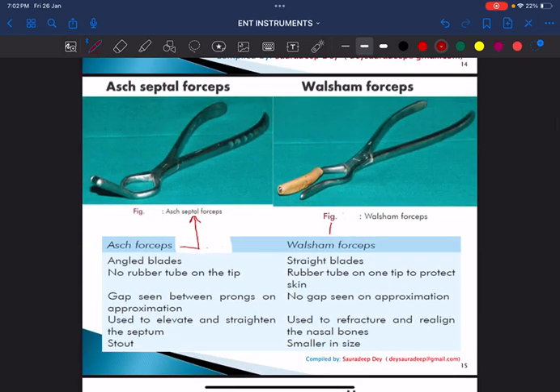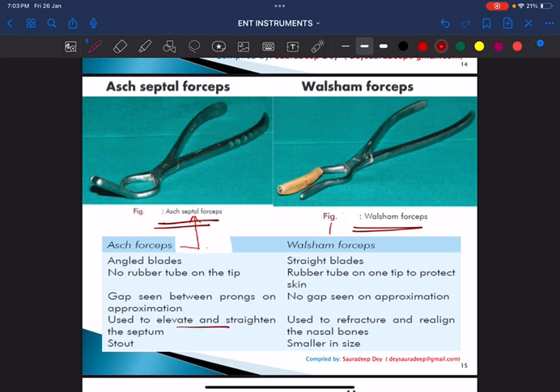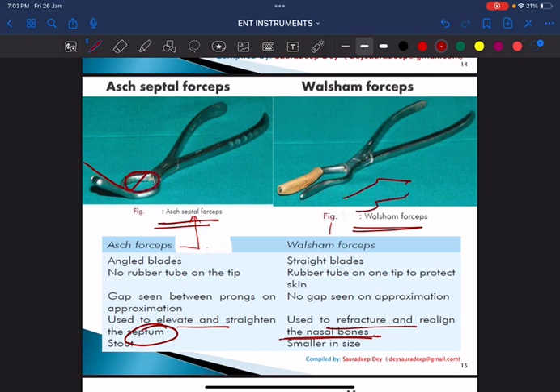These two forceps are extremely important. One is the Ash forceps, which is a septal forceps used to elevate and straighten the nasal septum. The other is the Walsham forceps, used to refracture and re-align the nasal bones. The Ash septal forceps has an elevated end followed by a bend and a circle, while the Walsham forceps is straight. When placed on a table, one instrument will be above the table level and one will lie flat — this is how you differentiate them.